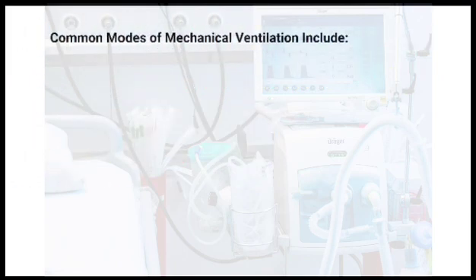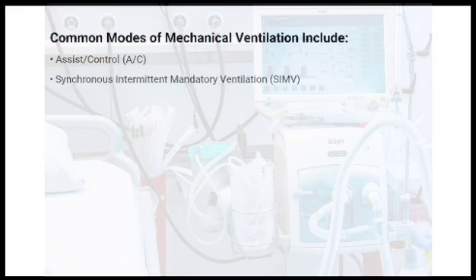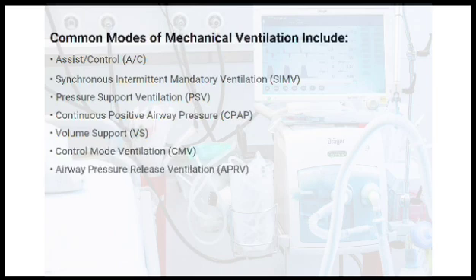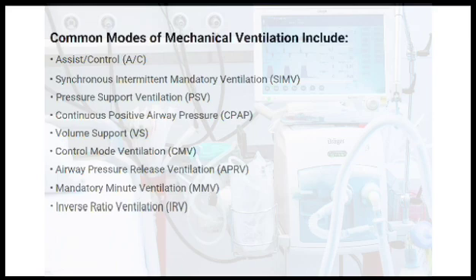Some of the common modes that you need to know about include assist control, SIMV, pressure support ventilation, CPAP, volume support, control mode ventilation, airway pressure release ventilation, mandatory minute ventilation, inverse ratio ventilation, and high frequency oscillatory ventilation.